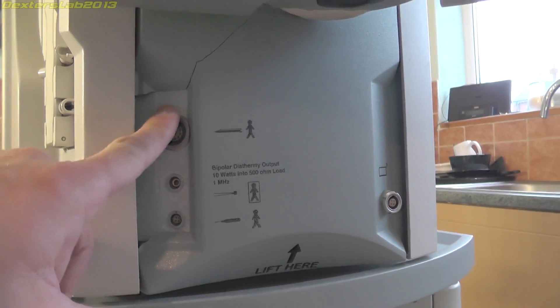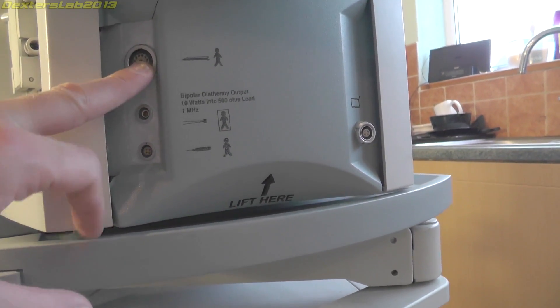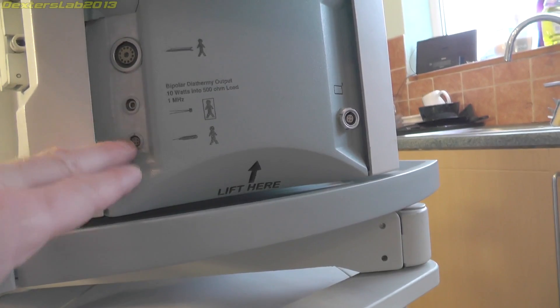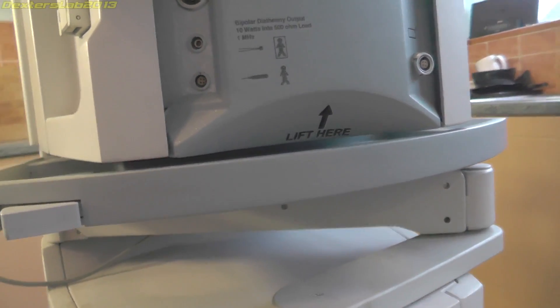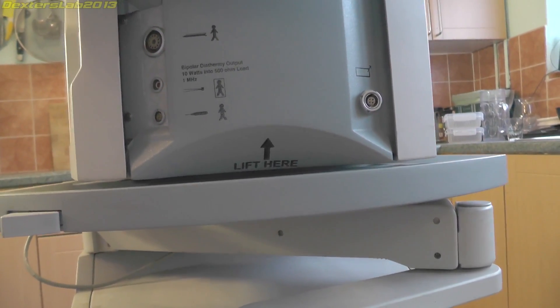Underneath there we have the outputs to all of the hand tools — that is the FACO tool and then we have a couple of other tools here. I'm not really sure what they're all for; I haven't really been able to find a huge amount of information about what all the tools are used for.